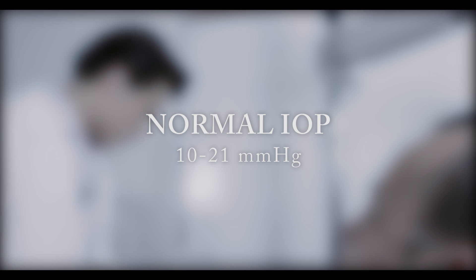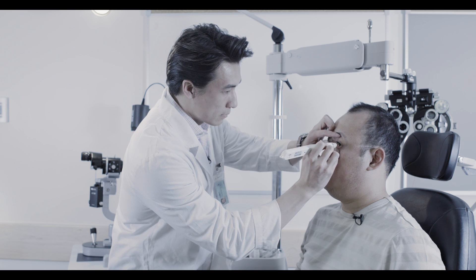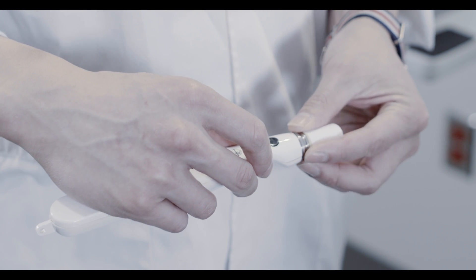Normal IOP is between 10 to 21 millimeters of mercury. Repeat this process on the left eye. Dispose of the tip cover after use and always replace it with a new cover before storing the instrument.